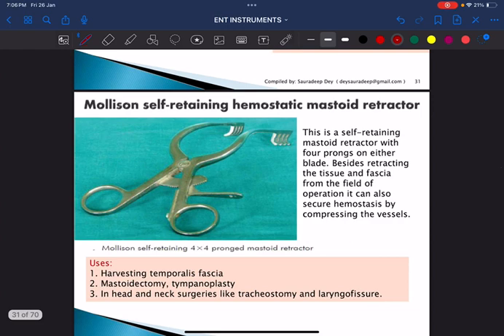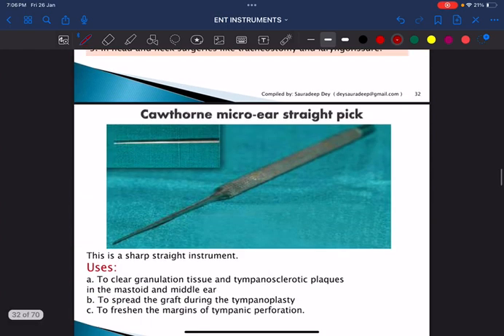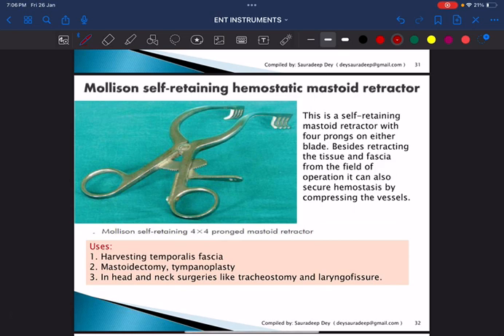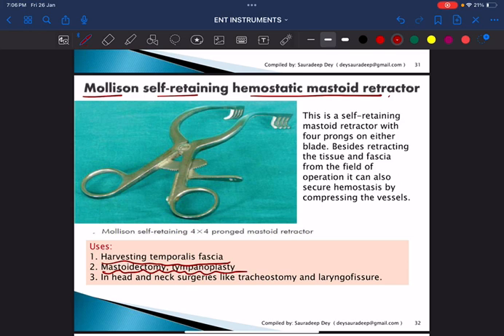This is the Mollison self-retaining hemostatic mastoid retractor, used for mastoidectomy, tympanoplasty, and harvesting of the temporalis fascia. It is used in both cortical and modified radical mastoidectomy. Always use the full name — Mollison self-retaining hemostatic mastoid retractor — as it impresses the examiner.